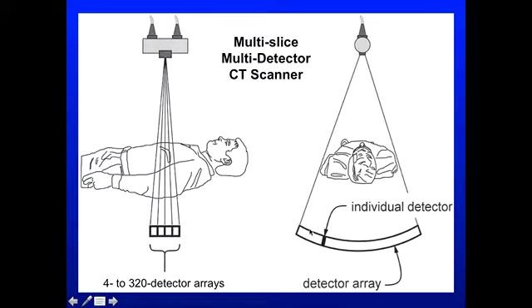The other way of speeding things up, though, now that I have all of my detectors along this way, say I have 800 or 1,000 detectors along that way, when I look in the orthogonal direction, the slice direction, this is the Z direction, right? I could just stack these things up. So I could take multiple slices, 1, 2, 3, 4 slices along here.